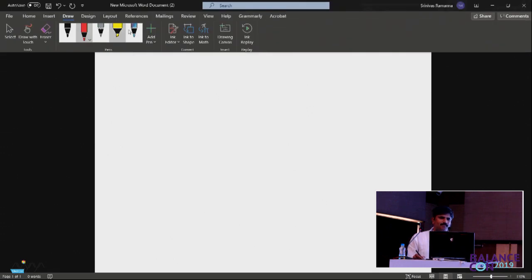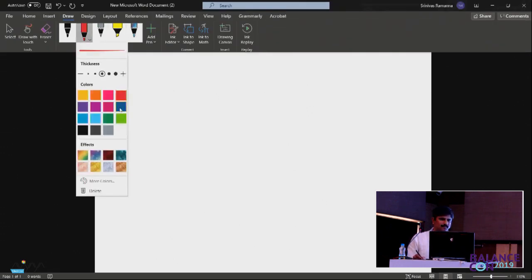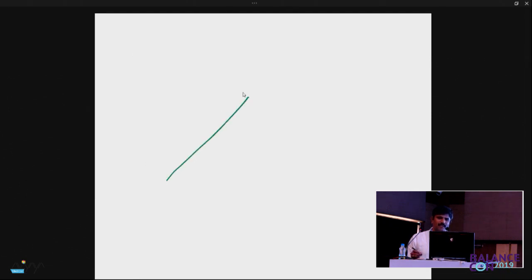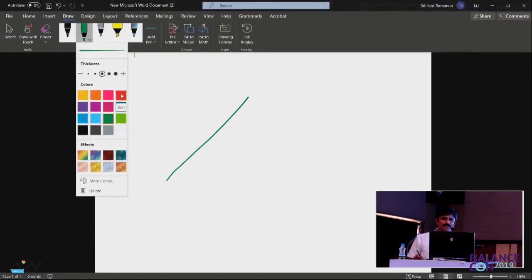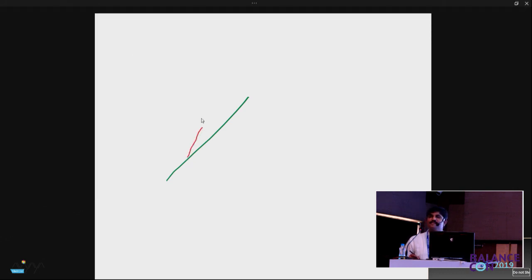Now, let us again draw something different. This is the thing that is moving. Let's imagine that the eye is now faster than the target, because of an underlying nystagmus or nystagmic intrusion, whatever it is. The eye is moving faster than the target. So how will this look? More steeper or less steeper? More steeper. So it will go like this.